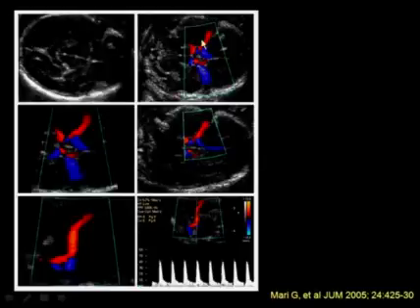Here you can see the steps that we described at the beginning of the 90s, but we did another study at 2 different institutions with Dr. Abu Ahmad 6-7 years ago. These are the steps that we should use when we want to measure the real blood velocity at the level of the middle cerebral artery.